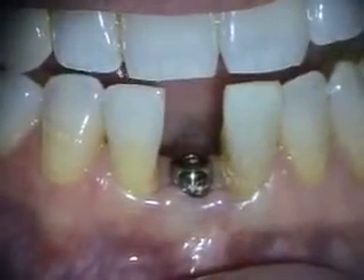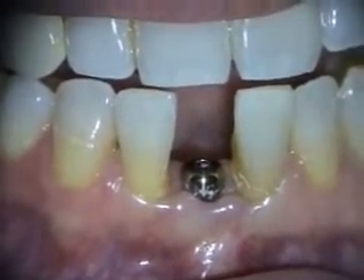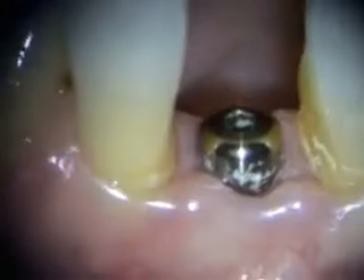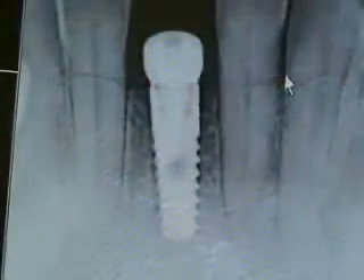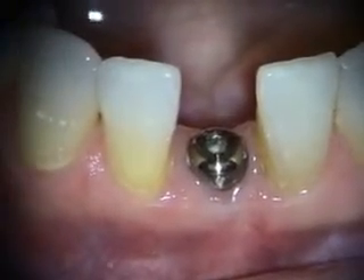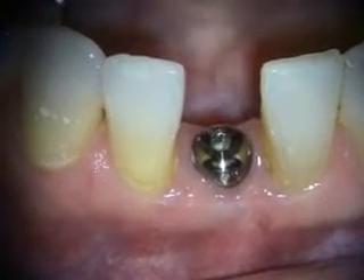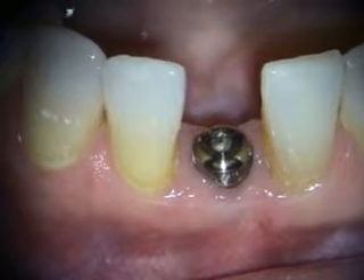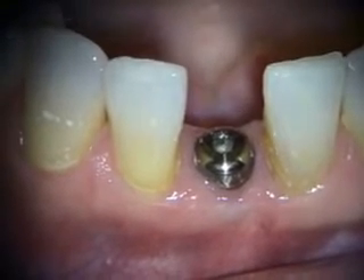This is a three-week look at the implant placement in the number 25 site. We'll take a look at the x-ray next. This is the six-week healing of the implant placement in the number 25 site, and she's ready to go for the restoration next.